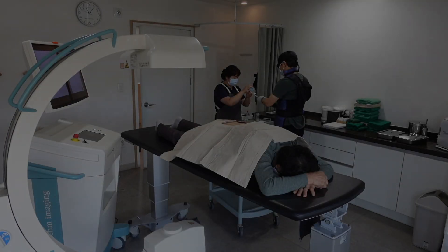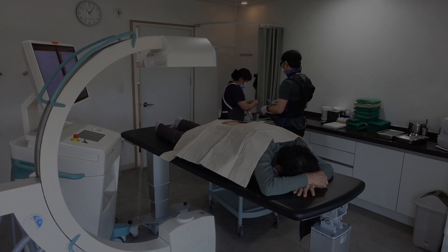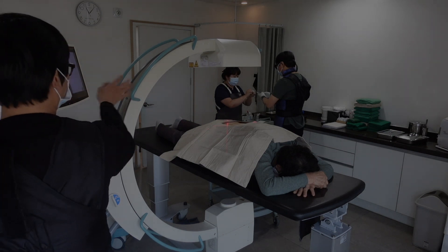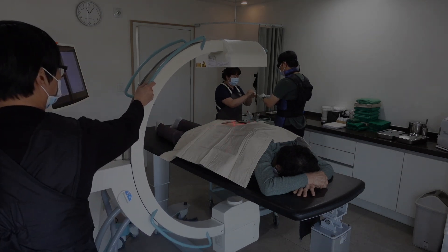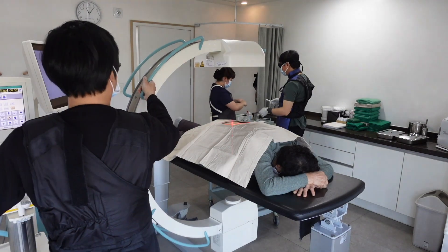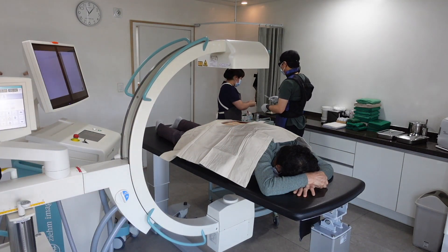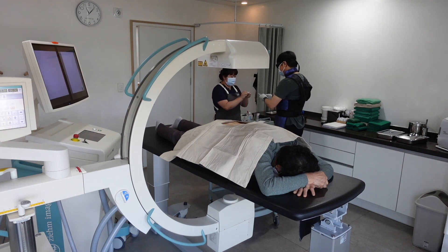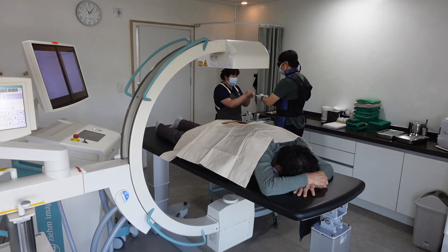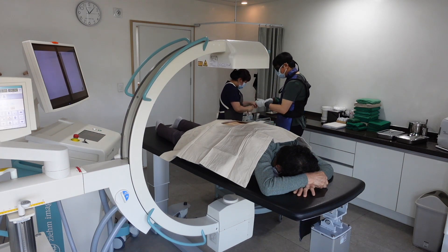Welcome back. This video will show you the interlaminar epidural injection technique using AP and contralateral oblique C-arm image guidance. The interlaminar epidural block is common practice in primary pain clinics. Most doctors insert a needle on the AP image guidance and confirm the final needle position by lateral C-arm view.